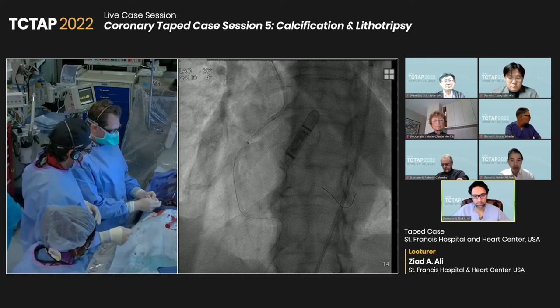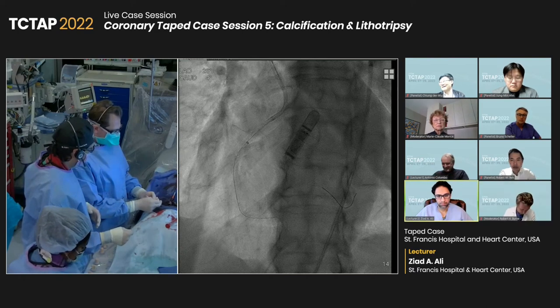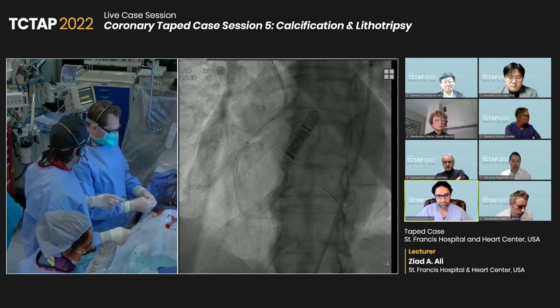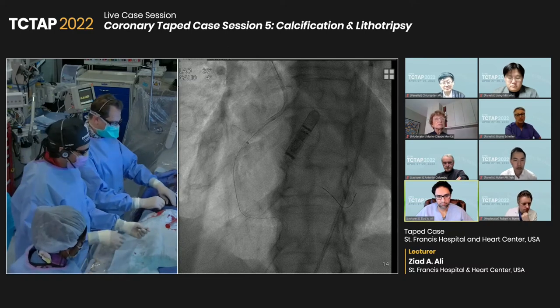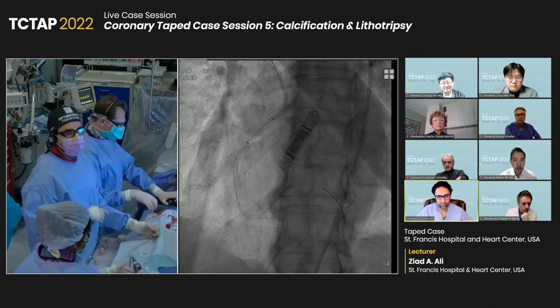Ionic media. Yeah, I like that. The ionic contrast media. I'll bring that up tonight at dinner. If you have non-ionic contrast, the shockwave won't work? Really? Yep. In Germany, they use non-ionic contrast. If you put it in and press the button, it doesn't do anything. Nothing happens. That's cool. Very nice.